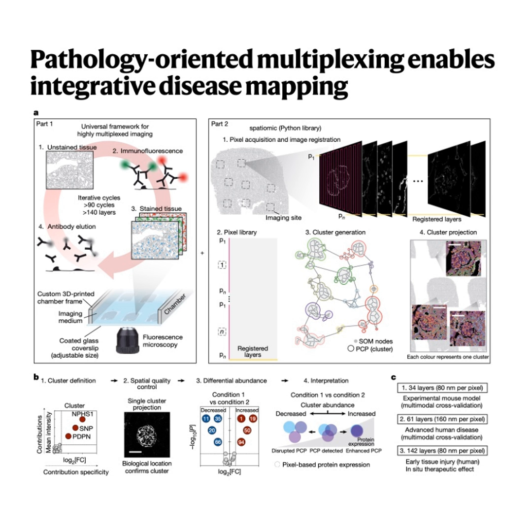What happened when these early-stage patients were treated with SGLT2 inhibitors, a standard diabetes medication known to protect the kidneys? PathoPlex provided a really granular readout of the drug's effects. The treatment did lead to a partial reversal of some of these early stress clusters. For instance, it helped normalize mitochondrial integrity signals in the proximal tubules and seemed to improve the health of the tiny peritubular capillaries. So the drug was working at the molecular level PathoPlex could see.